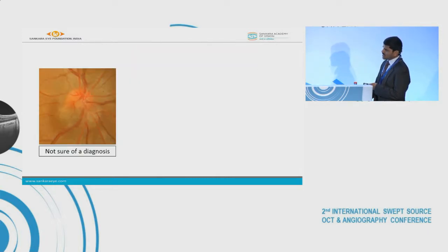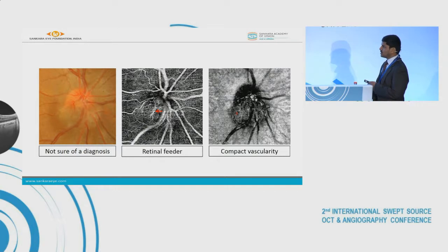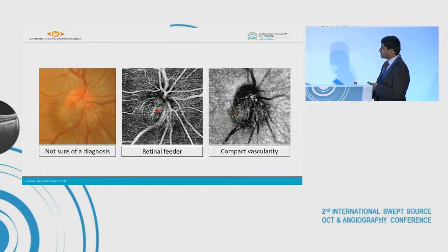Here we see a grayish tumor which is subretinal in location and juxtapapillary. We don't know the diagnosis, but when we perform OCTA we can see a retinal feeder vessel feeding the tumor, and if we ignore the projection artifacts from the superficial retinal vessels, we can see the tumor is composed of compact vascularity.